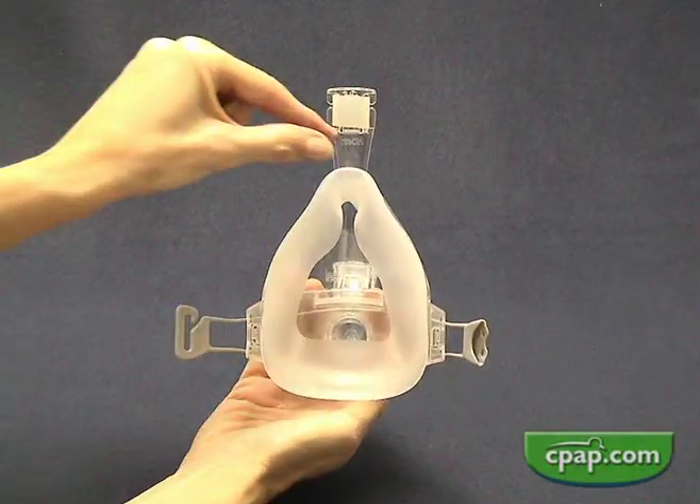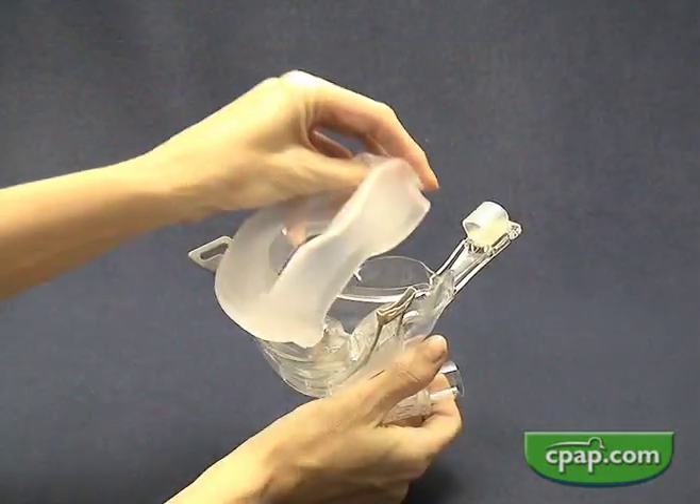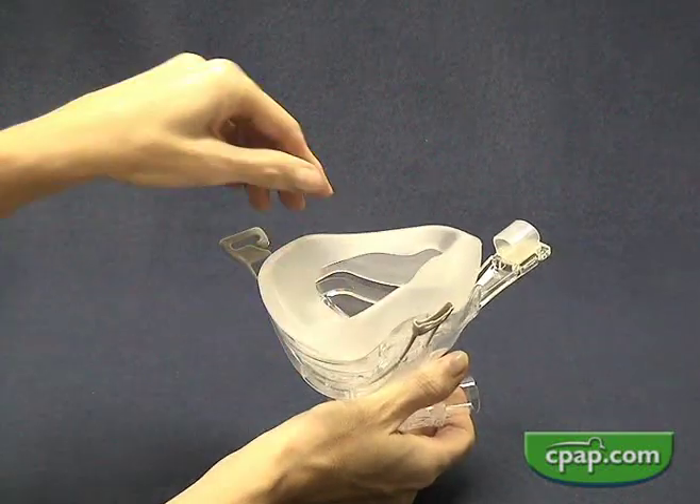Changing the seal size is easy. Just pull one cushion off and put another size cushion on. A wide range of users will find a good fit.